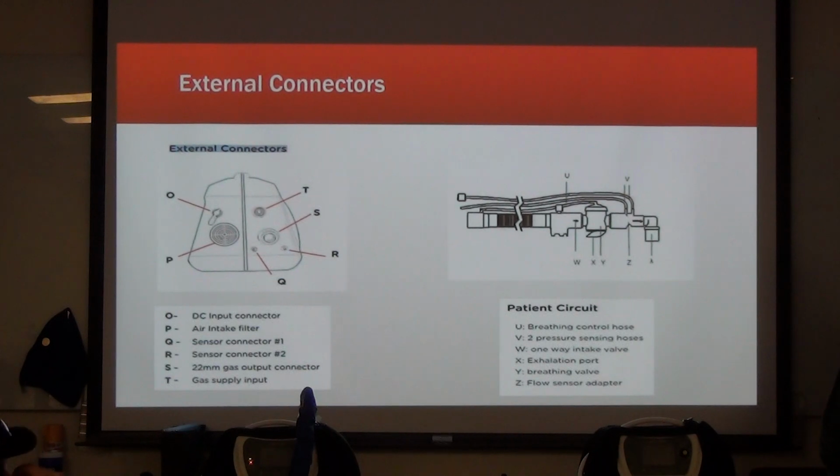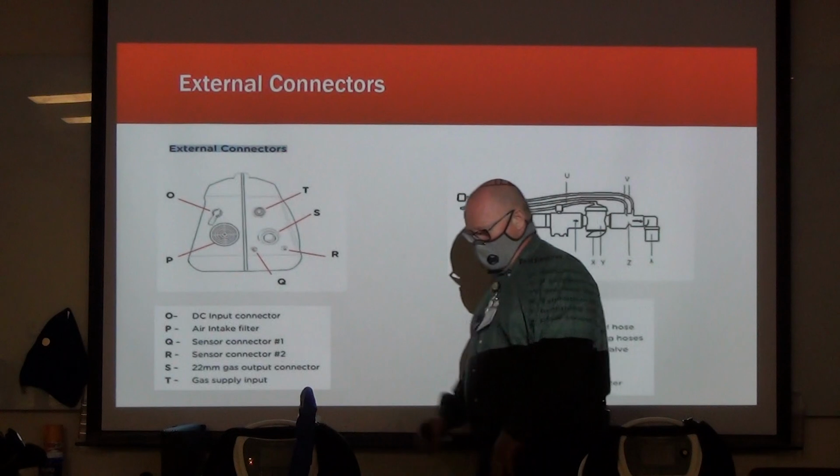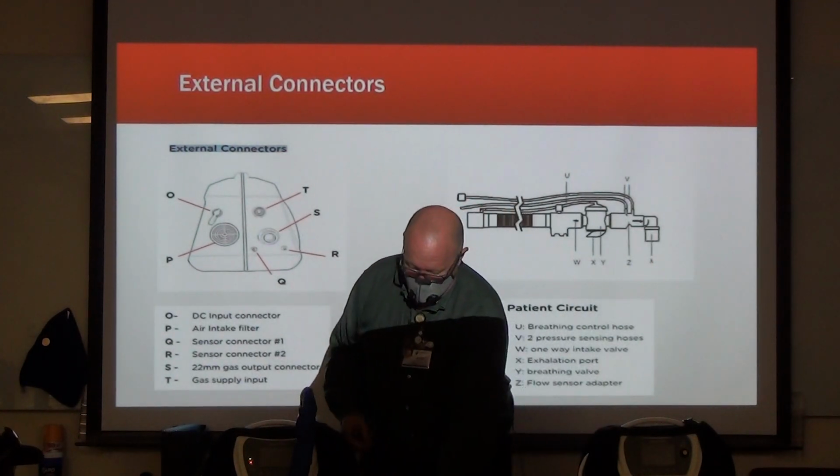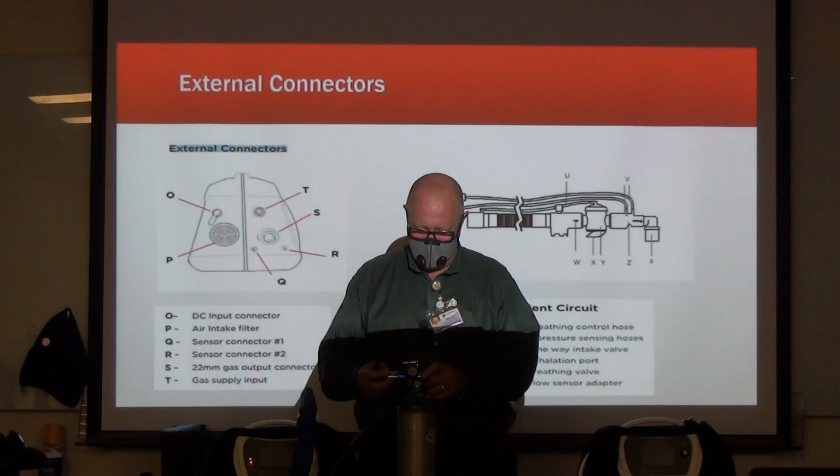It's a good deal. So very important that whenever you're checking off your equipment in the morning, that you make sure you have all the product. So you have to have your circuit, the charger, you have to have this regulator, and then your truck should always automatically have the bigger one.